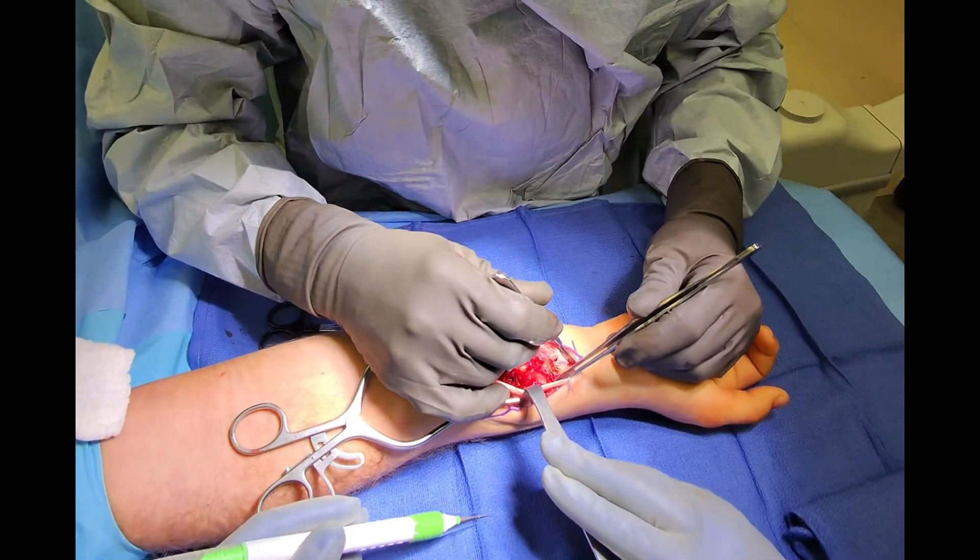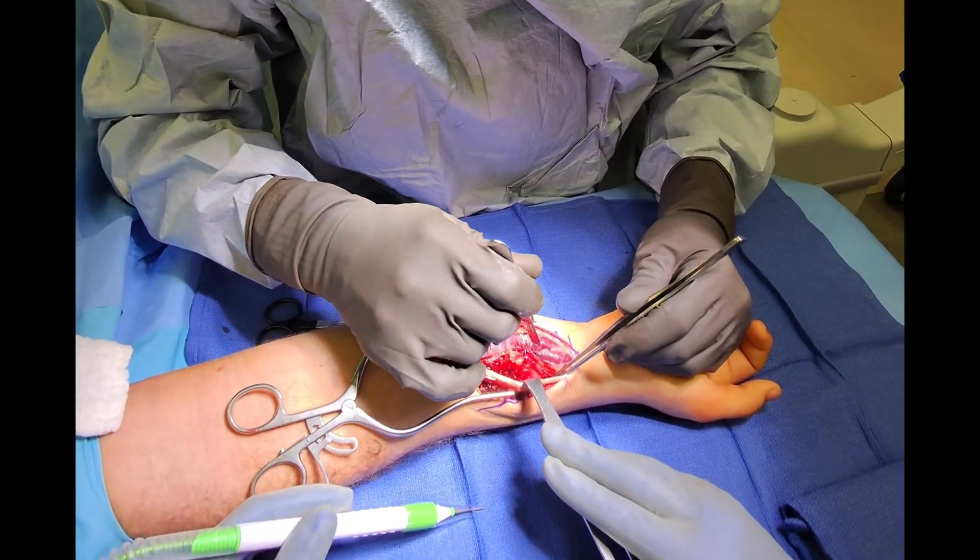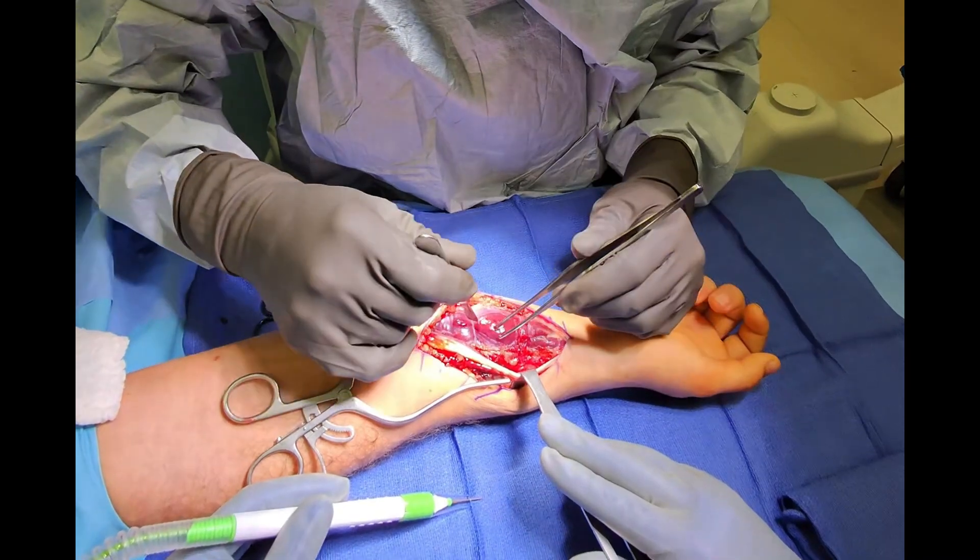This allows us to retract and move the forearm muscle bodies out of the way to expose the fractured bones.